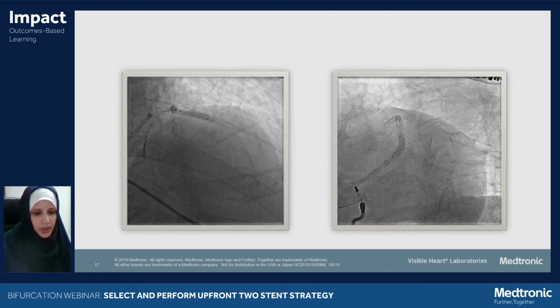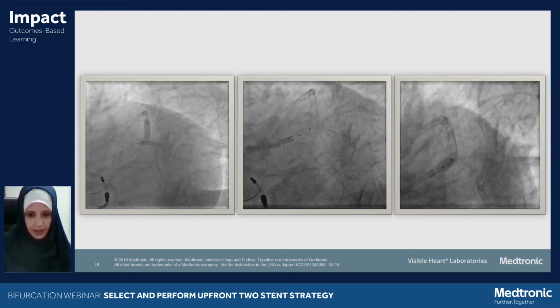So at this point, we continue with our ballooning. We do the high pressure dilatation of the LAD. We are doing our dilatation across into the left main. The first image that you have on the left side is the kissing inflation in the LAD. We've recrossed into the circumflex. We're kissing right now. Again, we're positioning our balloon for an appropriate proximal optimization, and then we're inflating.